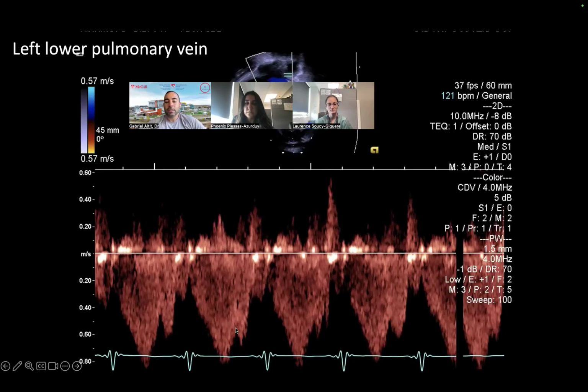During diastole, the mitral valve will open and the LA will empty very quickly into the left ventricle if the LV is compliant. Because of that, you get a reacceleration of flow inside your pulmonary veins, because the flow goes directly from the pulmonary vein to the LA to the LV. And then you get a little phase during atrial contraction.